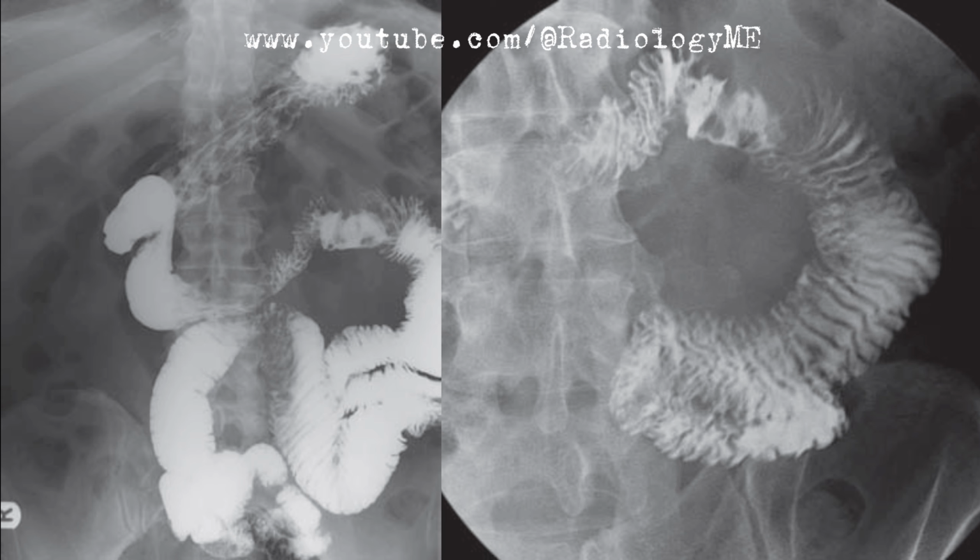Although this could be food debris, it's more likely something pathological. The caliber of the bowel lumen seems slightly reduced, but there's no tight stricture or upstream dilation to suggest obstruction, which is a key negative finding. Given these observations, my primary diagnosis is non-Hodgkin's lymphoma at the duodenojejunal flexure. This diagnosis fits the solitary lesion, especially given the absence of stricture or obvious ulceration.